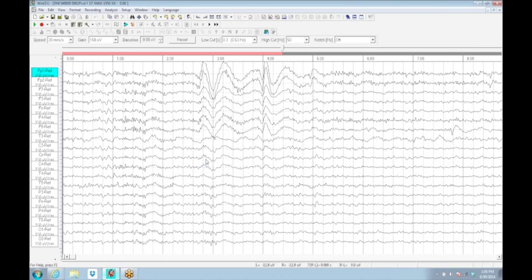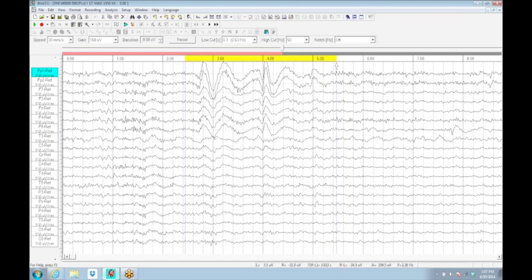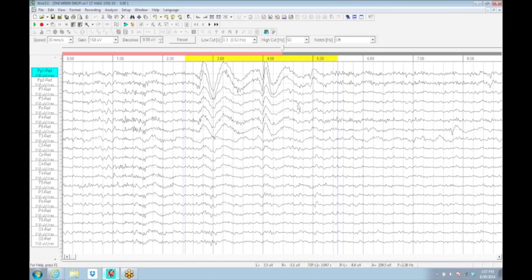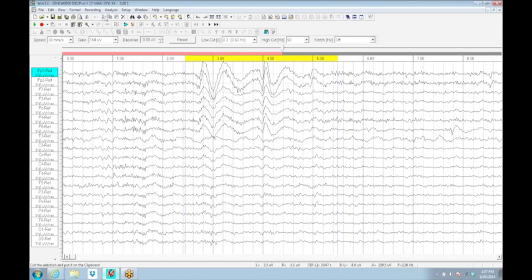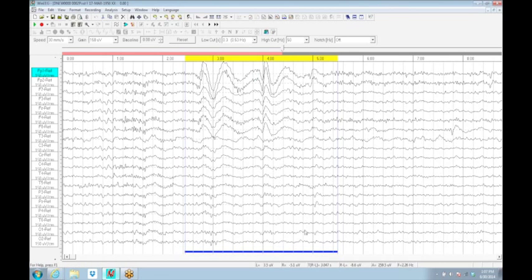Typically for QEEG processing, you'd want to remove sections of the EEG, like the eye movements that we see here. That can be done manually by clipping out or erasing sections of the EEG. If you clip them out, they're not going to be analyzed, but you can still see them. If you erase them, it'll collapse this across, so this will be gone.